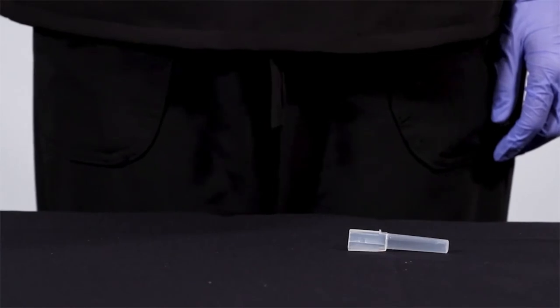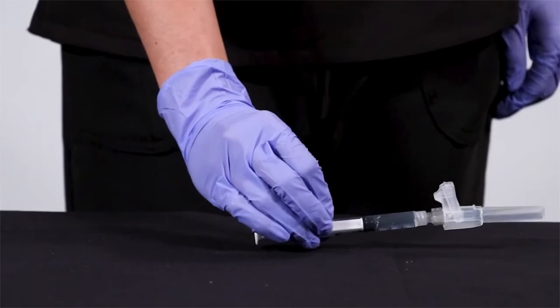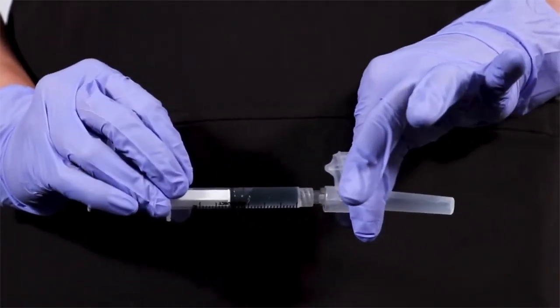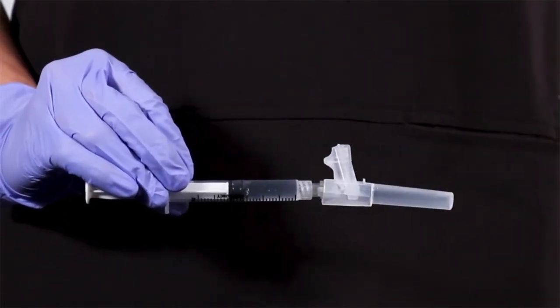Carefully aim the needle cannula into the sheath. Once the needle cannula is centered within the sheath, scoop and click the sheath back into place, making sure to keep your hand behind the needle at all times.